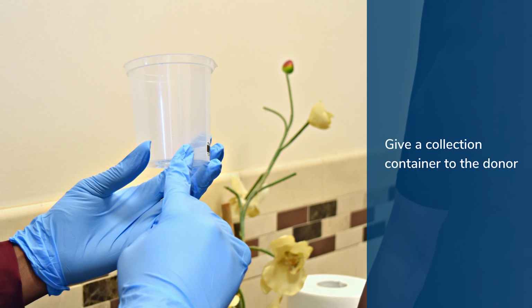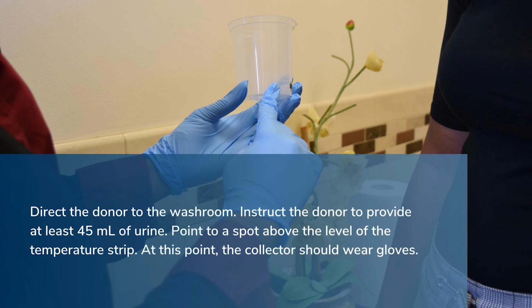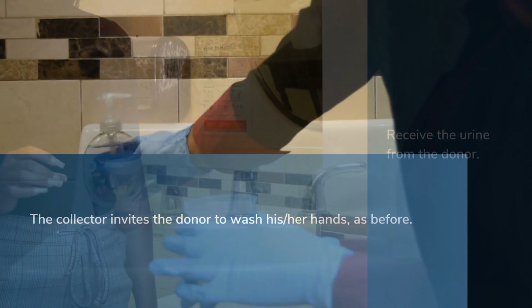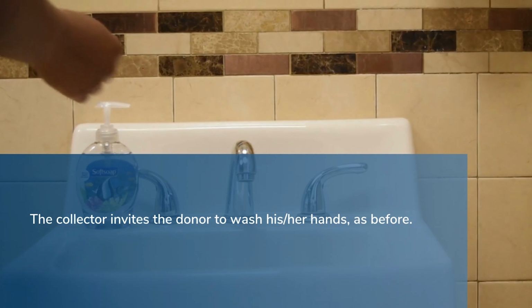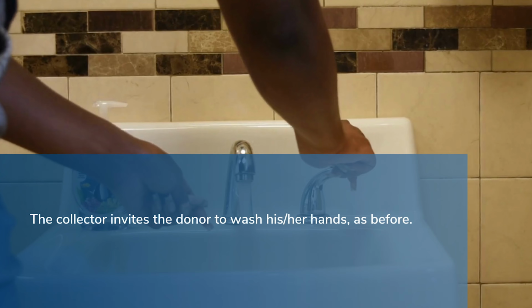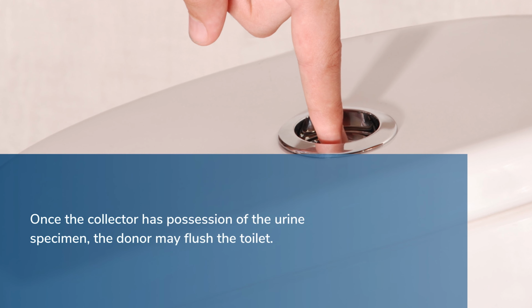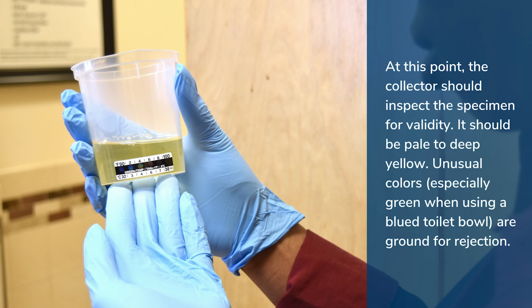Give a collection container to the donor. Direct the donor to the washroom. Instruct the donor to provide at least 45 milliliters of urine and point to a spot above that level on the temperature strip. At this point, the collector should wear gloves. Then, receive the urine from the donor. The collector invites the donor to wash his or her hands as before. Once the collector has possession of the urine specimen, the donor may flush the toilet.